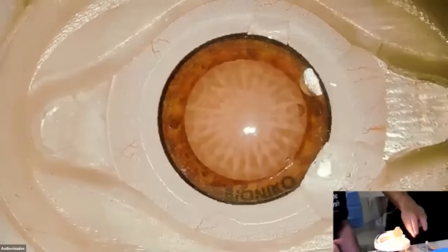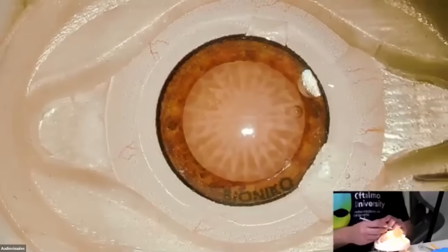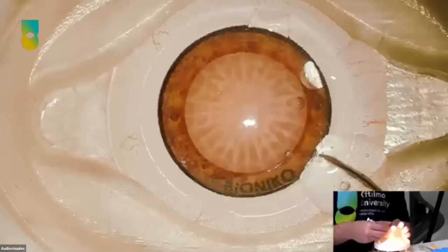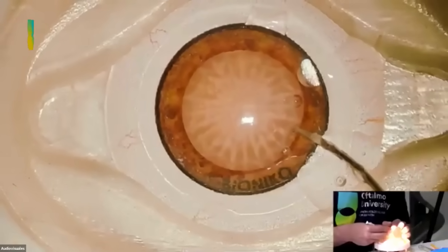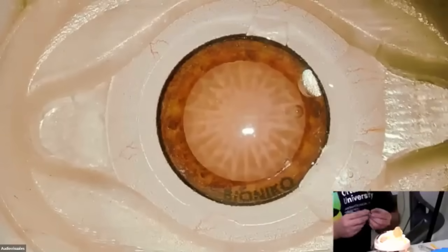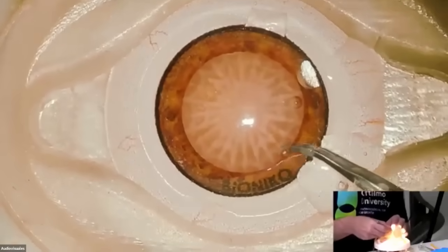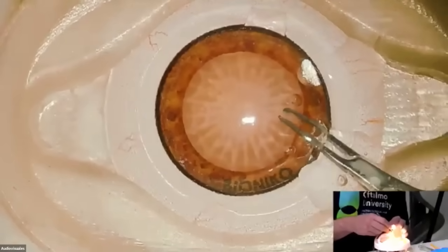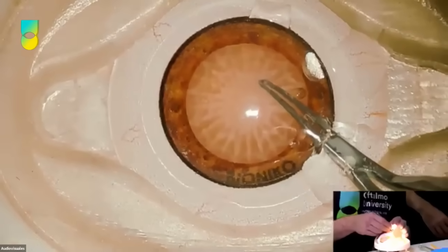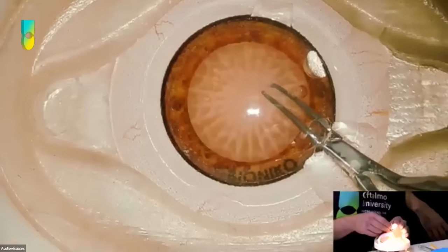Perfect. See? Excellent, excellent. Cecilia, any thoughts about this? I think it's what I was trying to say before. You have to learn both movements to use them when you need it, when you have to rescue a Rhexis. You have to have that movement trained so many times that when you need it, you do it with decision.